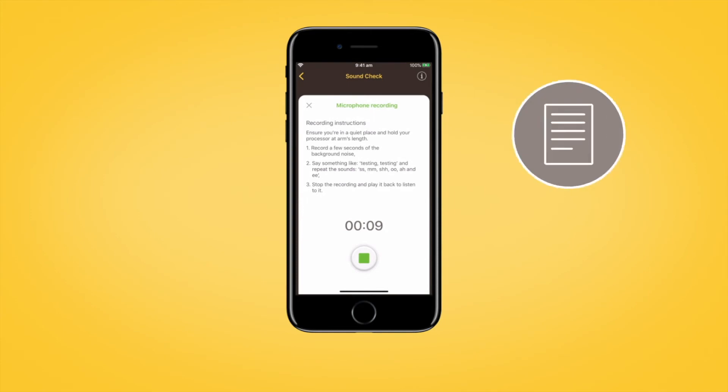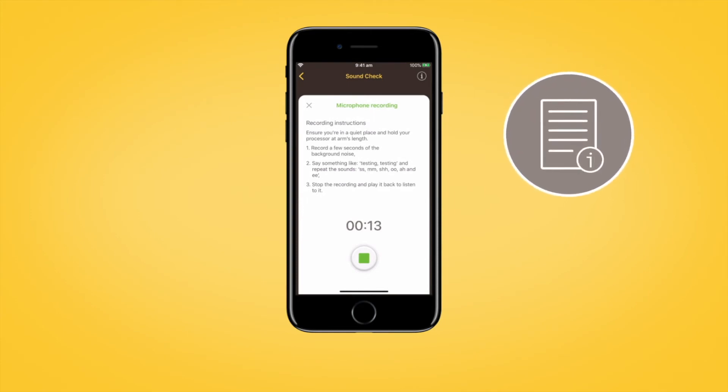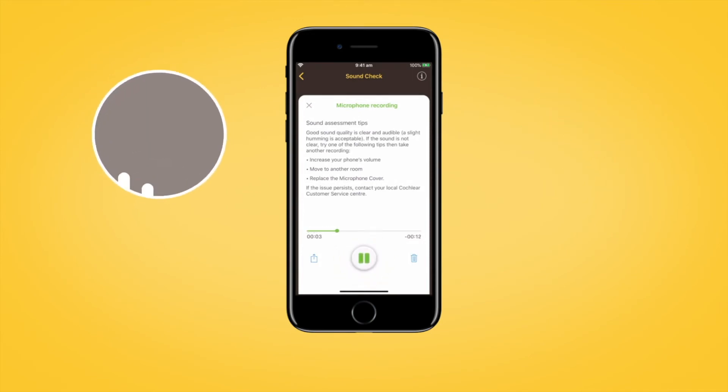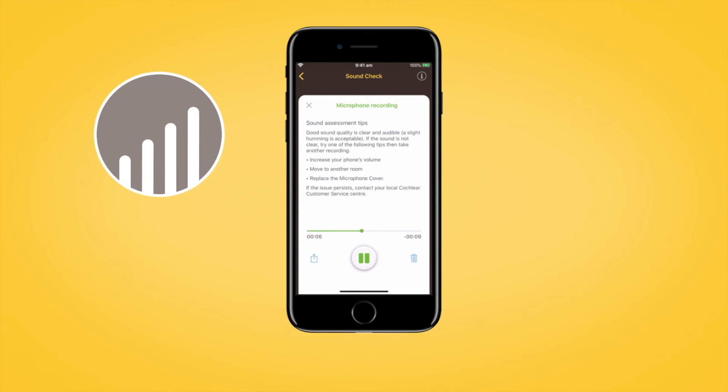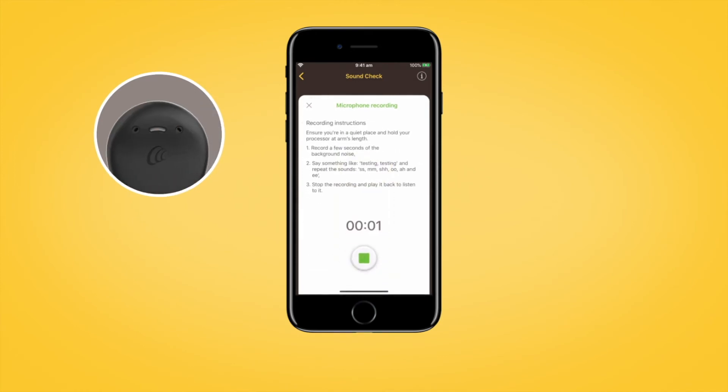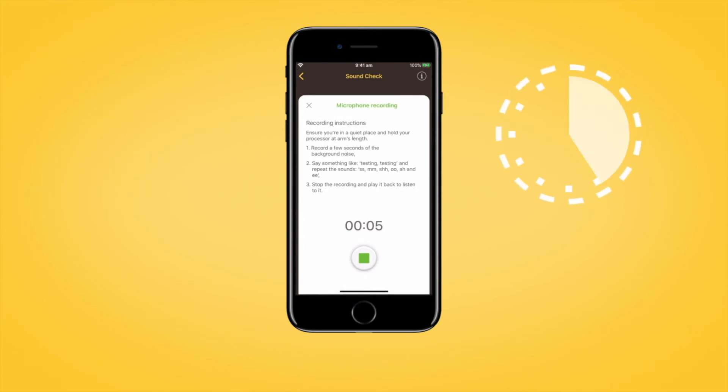There are in-app recording instructions and sound assessment tips to help you obtain a good quality recording. The recipient will hear an ascending tone sequence at the start of recording, and while recording, the Sound Processor Light will display steady blue. The maximum recording time is 30 seconds and the elapsed recording time will appear on screen. Tap the Stop button to finish recording.